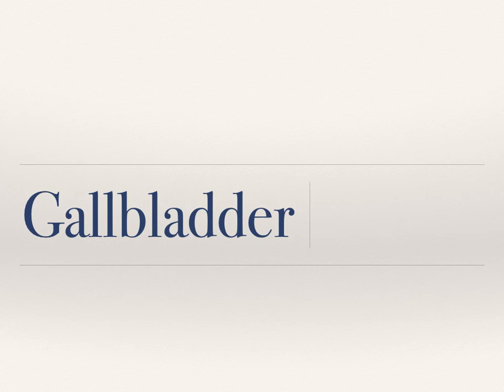Hi, this is Dave Kirshner, and this is a brief YouTube video on scanning the gallbladder. It's not going to be an in-depth look at every little piece of pathology that we're going to find, but it's going to go through the basics of how to position the patient, how to scan them, and some of the findings that you're expected to find.